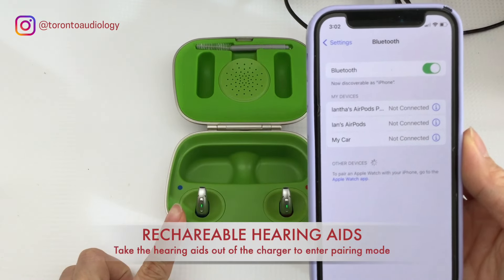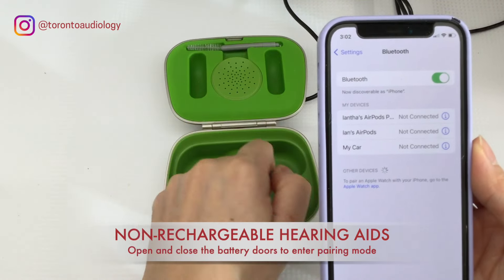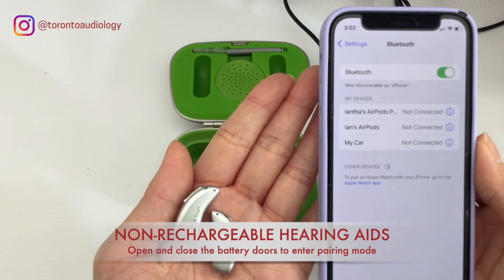If you have rechargeable hearing aids, you'll need to put them into the charger and take them out to put them in pairing mode. If you have non-rechargeable hearing aids, just open and close the battery doors.